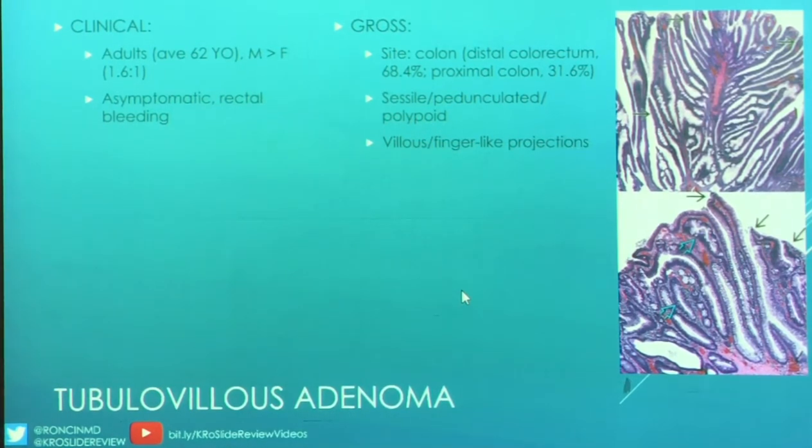Yes. And also in terms of grossing these things, if it's a large specimen, I think if I remember correctly, you really just want to focus on the base part. That is correct. So if you have this huge mushrooming lesion, you want to ensure that you have taken sections of all the sections of the stalk, the resection margin.